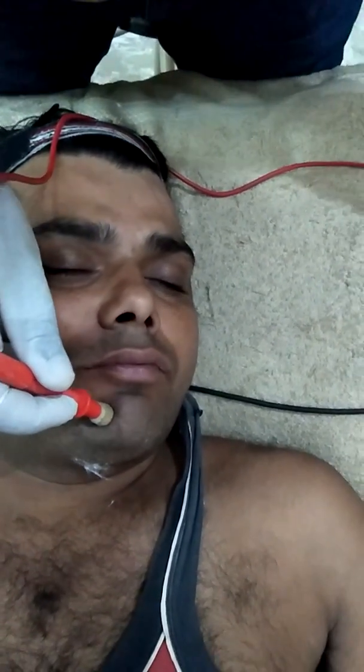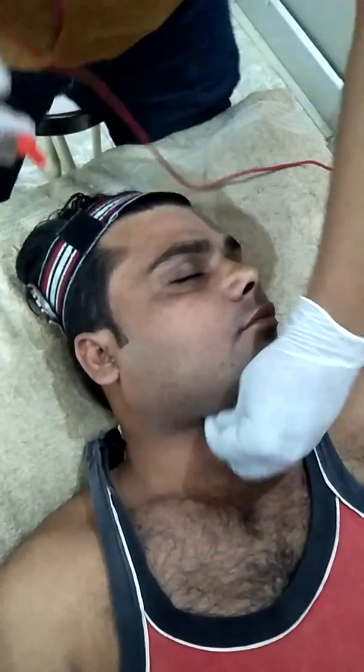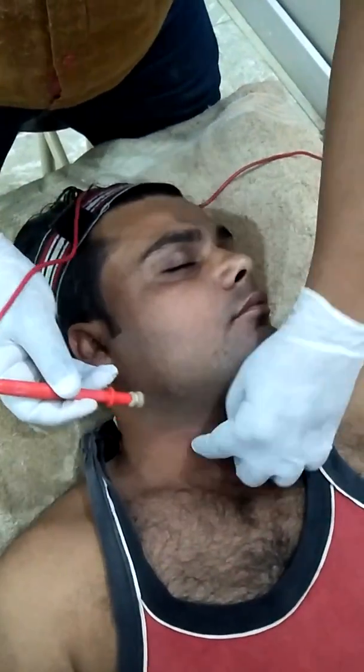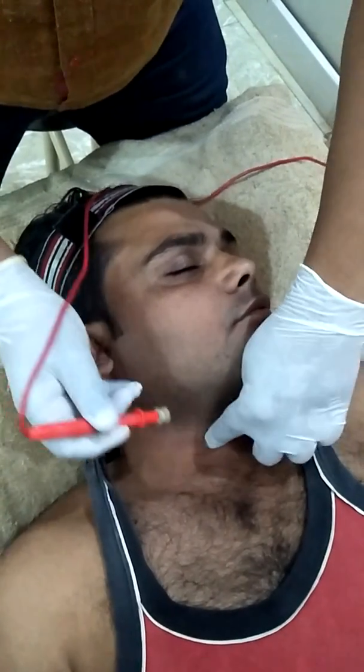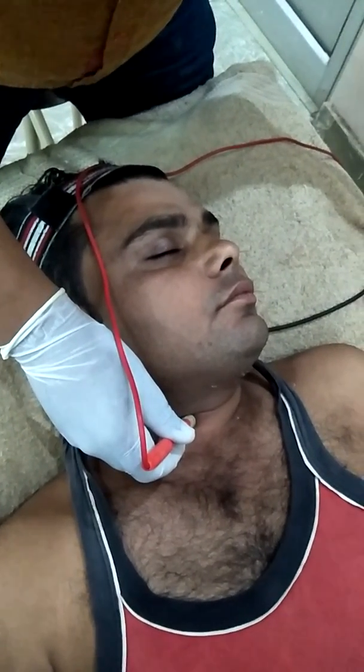Now going to another motor area, which is also related to the facial muscle, or say neck muscle. This motor point is there. When you put the electrode here, you see the contraction like this.